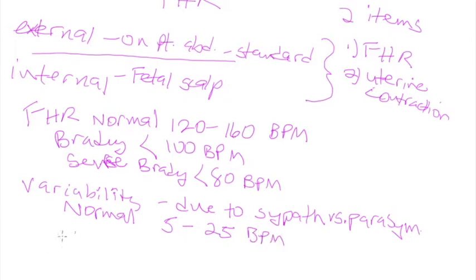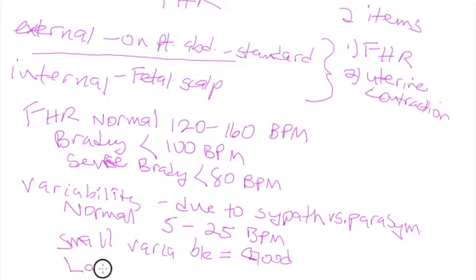Small variations, small variability, is usually good, whereas lack of variability is bad. That is either fetal distress, hypoxia, or fetal acidosis.